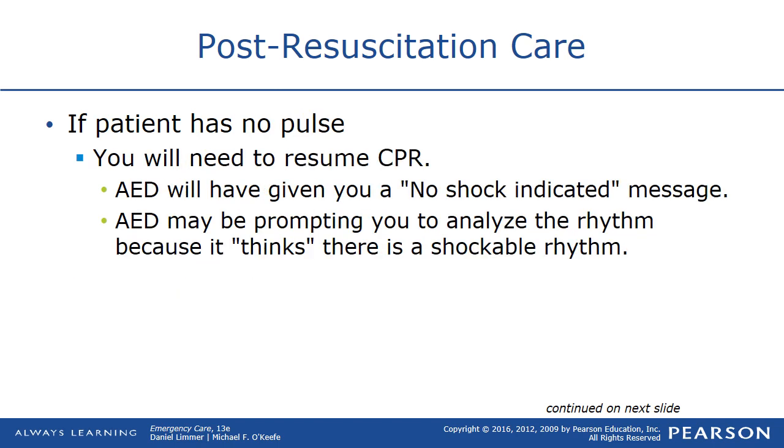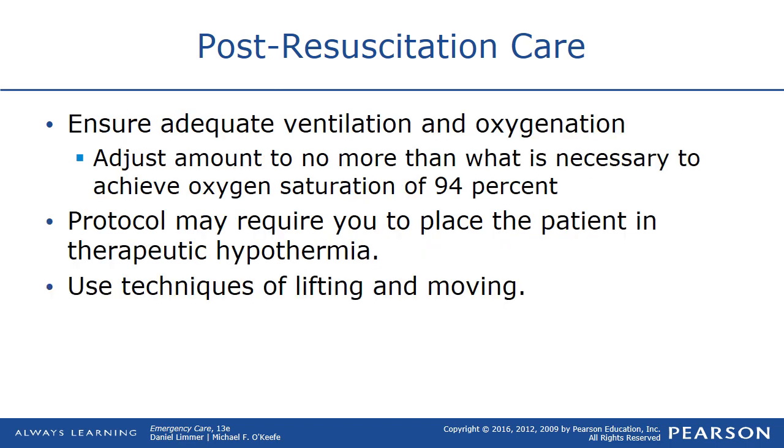If a patient has no pulse, you'll need to resume CPR. An AED will give you a no shock indicated message. The AED may be prompting you to analyze the rhythm because it thinks there is a shockable rhythm. Ensure adequate ventilation and oxygenation. Adjust the amount to no more than what is necessary to achieve oxygen saturations of above 94%.